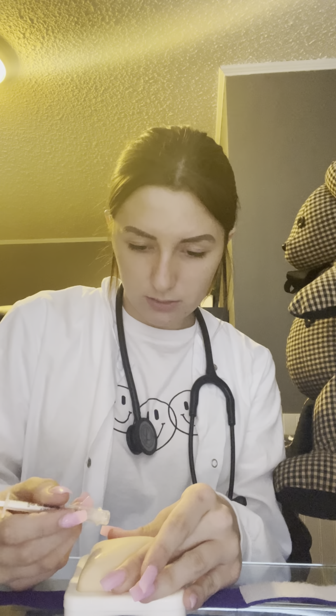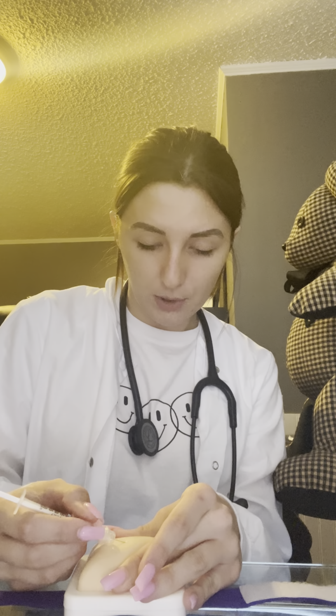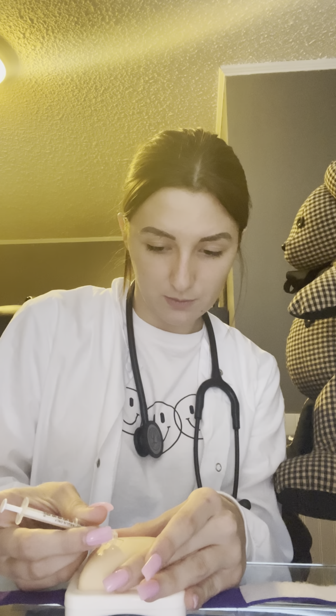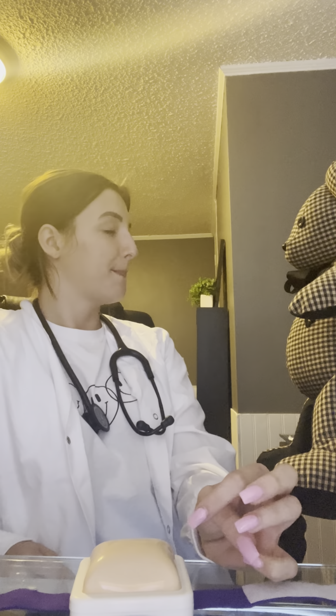So I'm going to pinch, put in at a 45, slow and steady, let go, and put the medicine in, and then I'm going to take it out. I'm going to dispose of this. I would keep applying pressure and then put a Band-Aid on when I'm finished. I'm going to monitor for drug response and effectiveness. Does that feel okay? Okay.